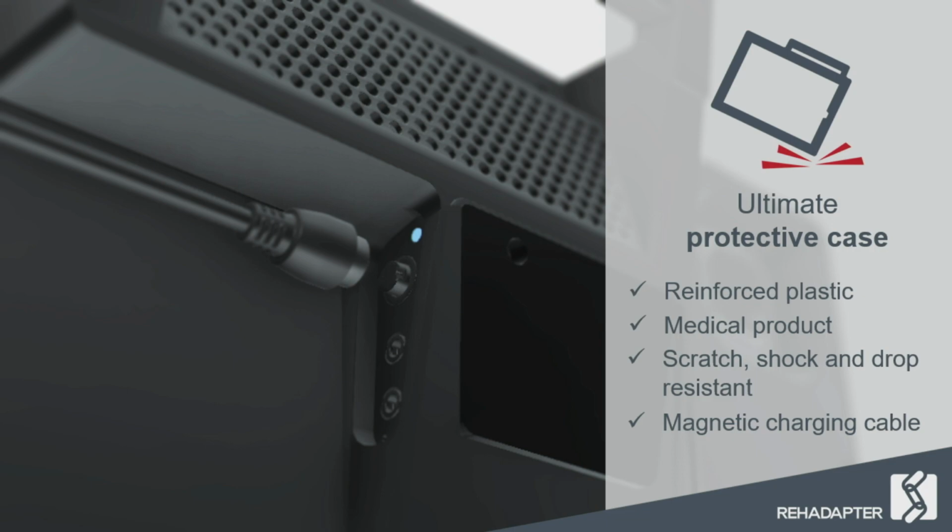to have a solution that could perform in daily life, for example in a scenario like school, without any stress. Often it happens that devices are not getting charged by the families or caregivers, and we had the scenario in mind: what would happen if a kid in a school would need to recharge the device, but still wants to be able to quickly take the device and take it away? So we found an interesting solution with a magnetic charging connection to charge the iPad without any problems. But as soon as someone takes away the Rehadapter, the magnetic charging cable is just released again.